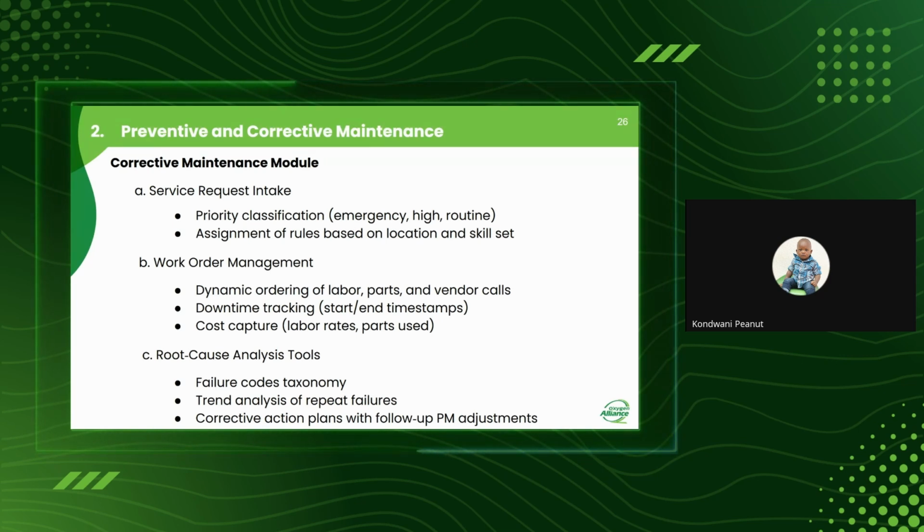ultrasound or maybe an X-ray machine. So I personally, in practice, put into account such small devices, because if you observe, they take almost 30 to 45% of total equipment available in the health facility. So if you omit them, it means you're omitting the greater part of the equipment within the health services, and you may see the services being compromised.